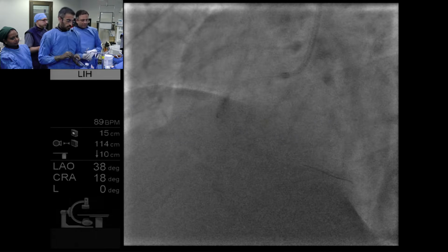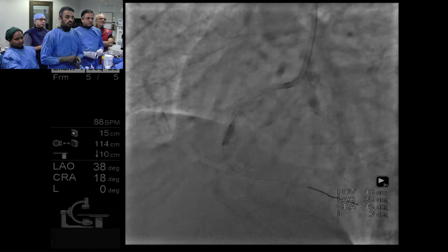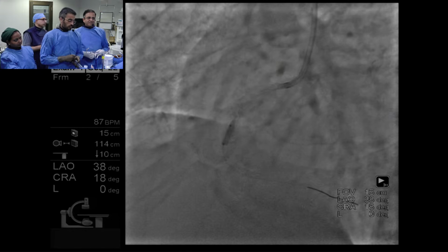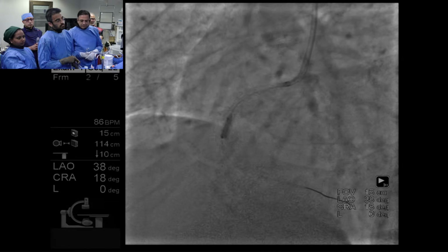Maybe a little bit above where we need it to be, but we'll see. Although we got it, I think we got it. Once you cross 6, we go up faster.